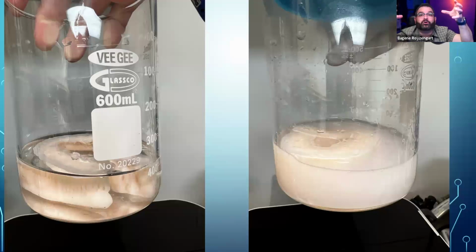Now, let's say you're mixing up 2 batches in the beginning. You use the dirty one first, and then you use the clean one, okay? After you use the dirty one, go ahead and throw it out. And next time you're doing another case, you can use the clean one that you used before as your first dirty one for the next batch. So every time I do it, I always save one for later, and then I'll dispose of it next time. So you only have to mix 1 batch each single time. The only time you have to mix 2 batches is the very first time you start, okay? Hope it makes sense, guys.